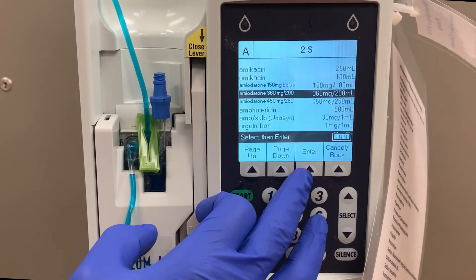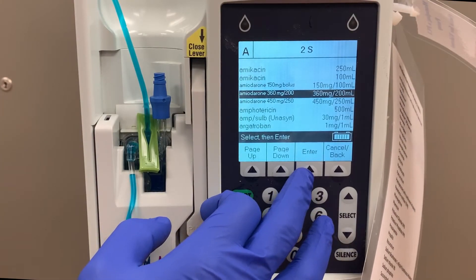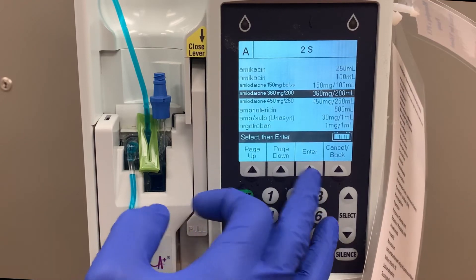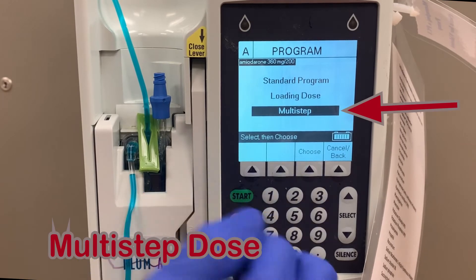In order to use the loading dose or multi-step program options, you'll need to use the drug library and identify the medication you're going to use. We'll use amiodarone for this example and choose a multi-step program.